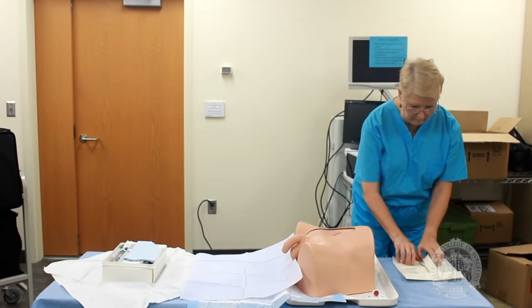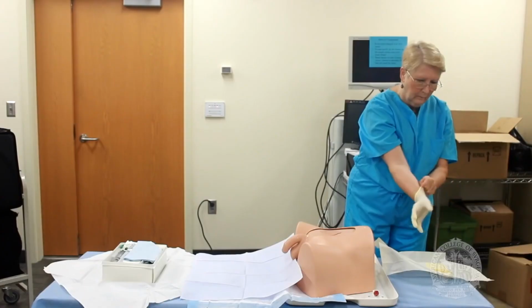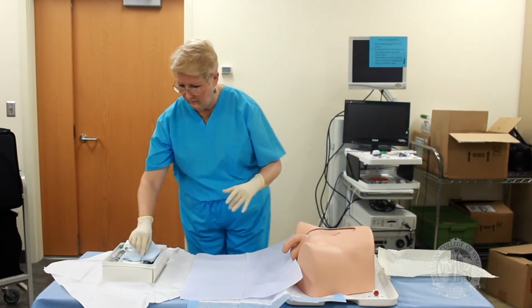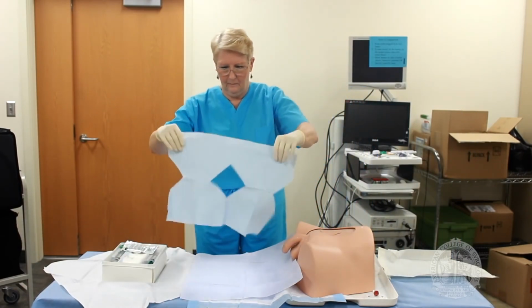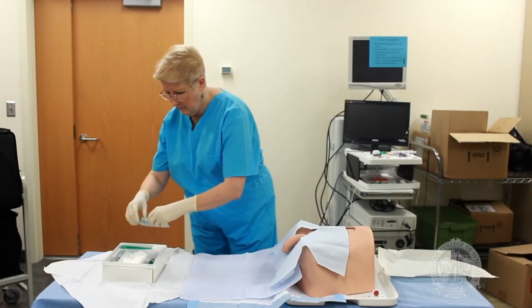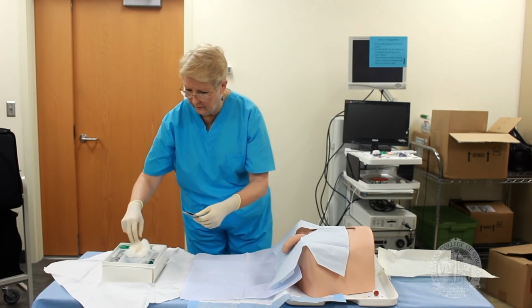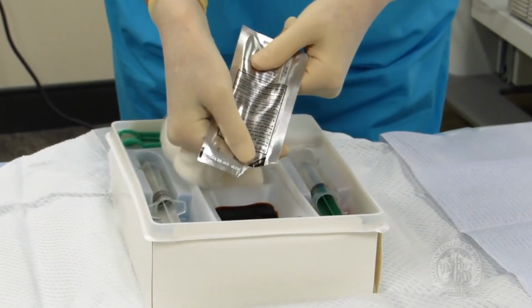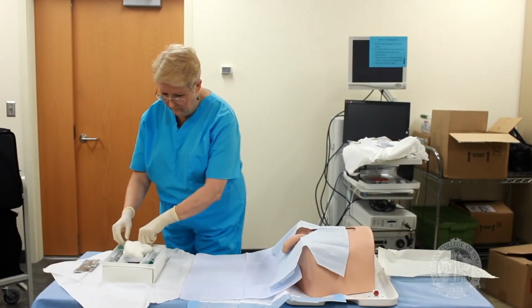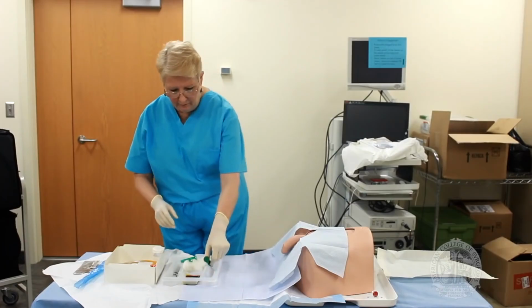Now, don your sterile gloves, like so, making sure you have nothing below your elbows, such as a watch or ring. Open the fenestrated drape and place it on the patient. Tear open the iodine and pour it into the well in the tray. Lift the top tray out and place it in the sterile field in front of the rest of the box containing the actual catheter and tubing.